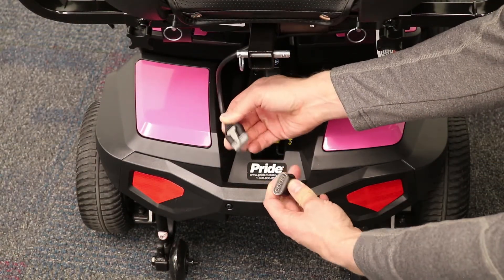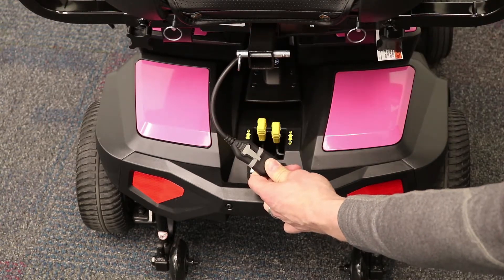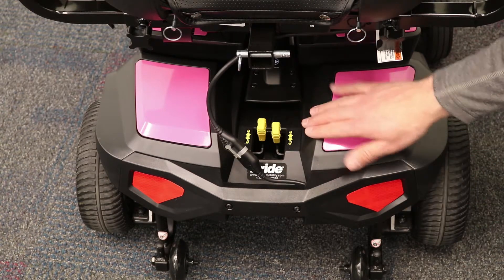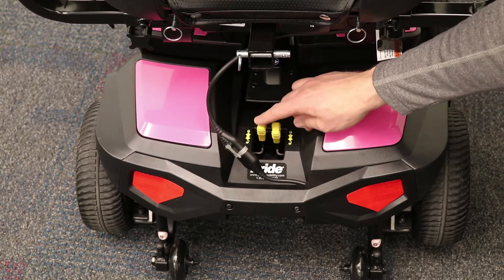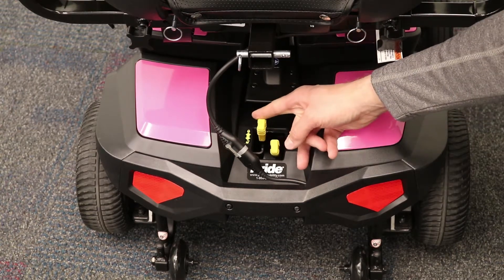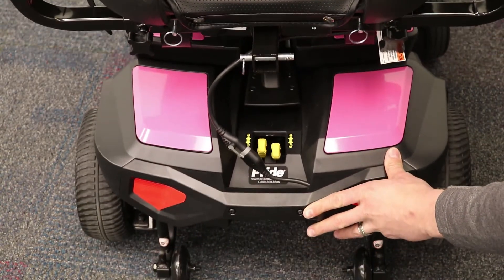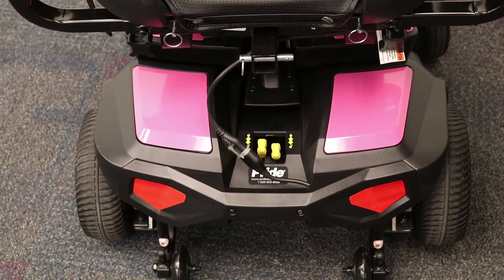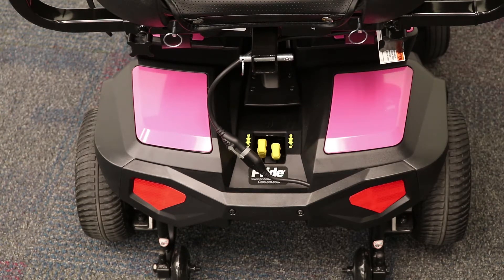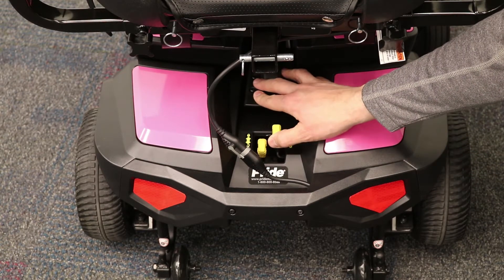One other important part I want to point out. In the rear of the power chair, there are two yellow levers. These levers are the freewheel levers. These will disengage the motors so you can manually push the chair if needed. Be aware that if these are still in freewheel mode, the power chair will not turn on and the joystick will blink with an error code. If you ever have an error code blinking, we advise shutting the power chair off and double checking both of the motors so that they are properly engaged.